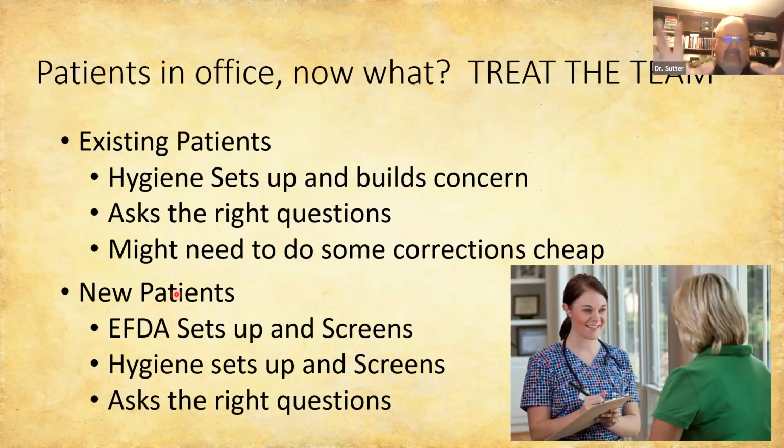And that is what traditional dentistry is responsible for, right? So it's not about just looking at the bite and saying, okay, I'm going to write down my overbite, this is my overjet, Angle's class 1 molar occlusion, good. We never talk about the bite again. Or maybe you're going to take some models and mount them. That's great. The patient isn't going to understand what you're looking at anyway. And it's not going to tell you anything about timing. It's not going to tell you anything about force distribution profile, right? That's what the T-scan is going to give us.